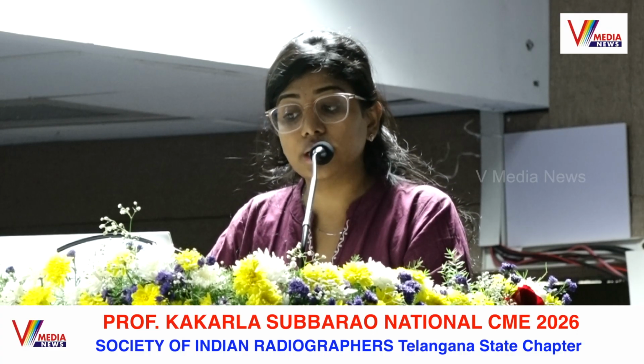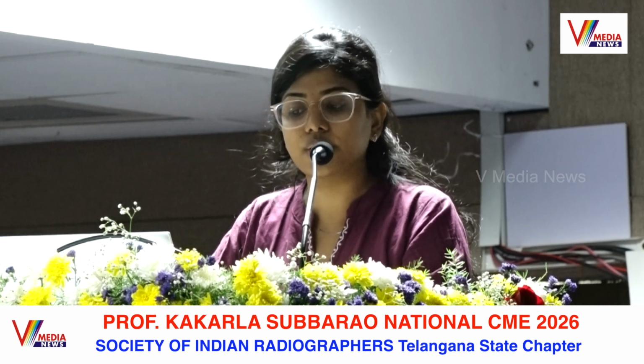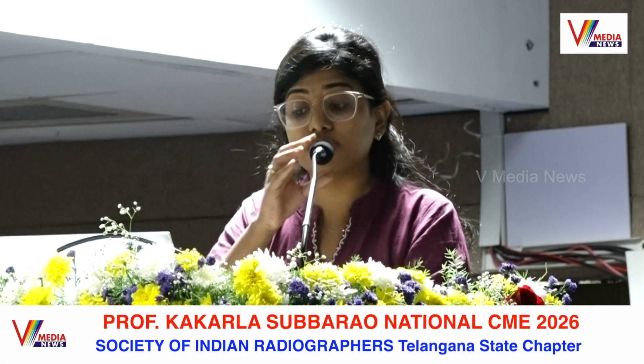Coming to the indications: in evaluation of coronary artery anomalies, atherosclerotic coronary plaque and occlusive disease, to know the patency of the CABG, stent patency, and evaluation of coronary artery disease due to atherosclerotic and non-atherosclerotic causes, and as an alternative to invasive coronary angiography when it is not feasible or it carries higher procedural risk.